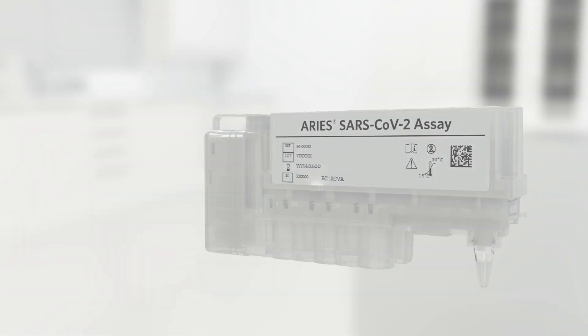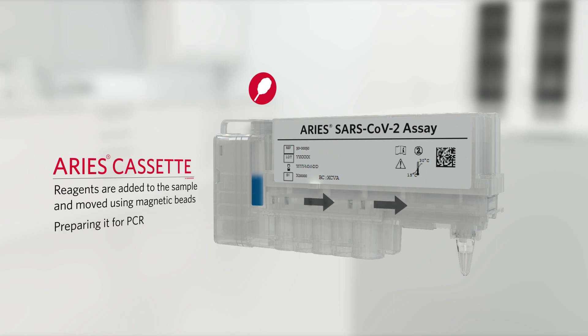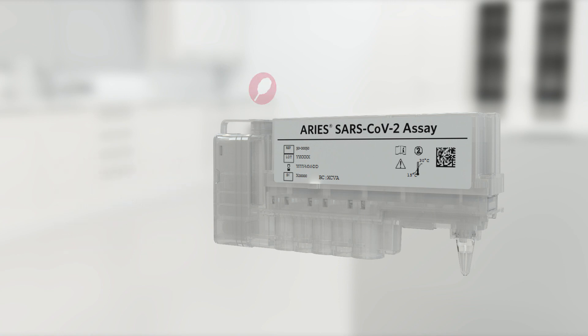During processing, reagents are added to the sample and the sample is moved using magnetic microparticles through a series of washes inside the cassette, preparing it for PCR. PCR amplification and detection take place in the PCR tube at the opposite end of the cassette, where the PCR reagents and primers are located.